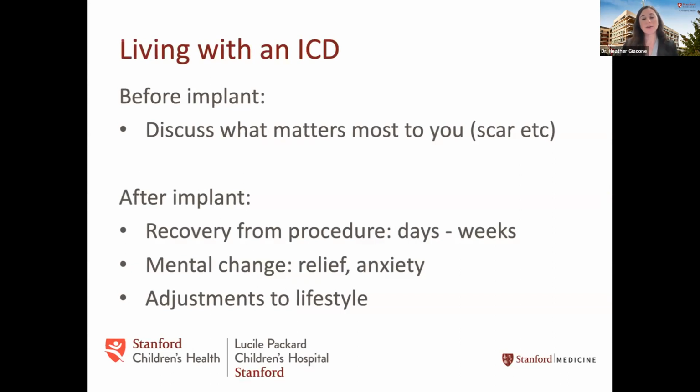After implant, know that there's going to be a recovery from the procedure. The true recovery is on the order of days, and then we may alter how you're able to move your arm or participate in different activities for the next few weeks. But of course, there's a mental change. Some patients come to me and say, I have such a relief that I have an ICD, I can sleep better with it. Some patients are on the other side, saying, I have more anxiety, what if I do get shocked?